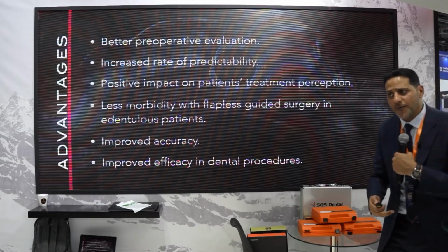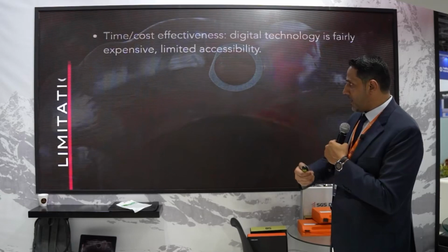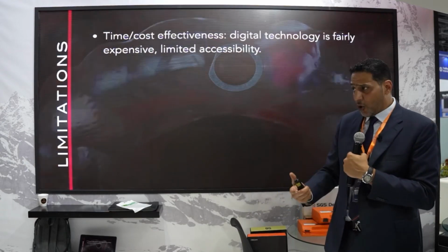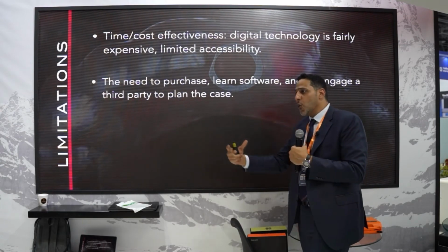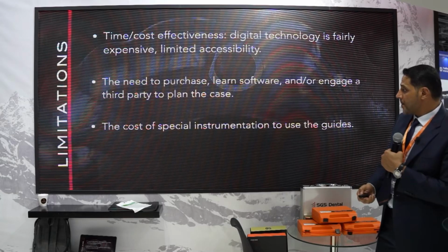This is the advantage of the digital CAD/CAM surgical guide. The disadvantage or limitation is cost and time consuming. It costs money. You need a software, you need a scanner, you need the tools of the digital workflow.